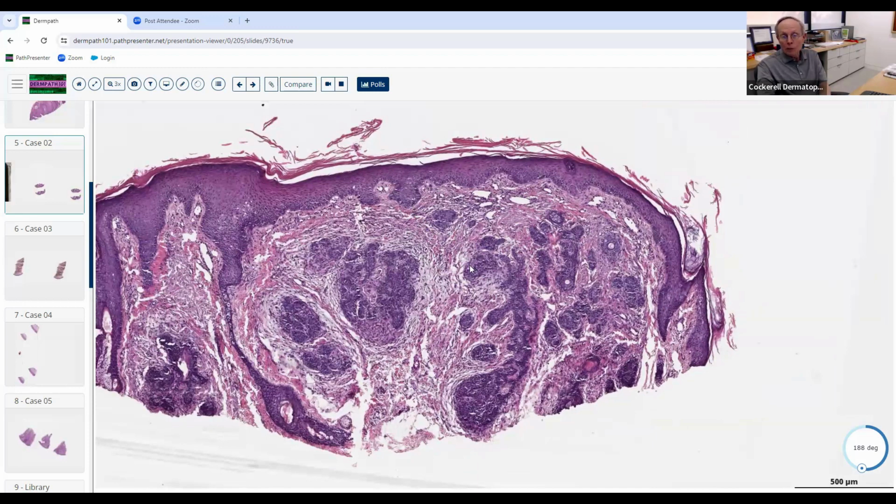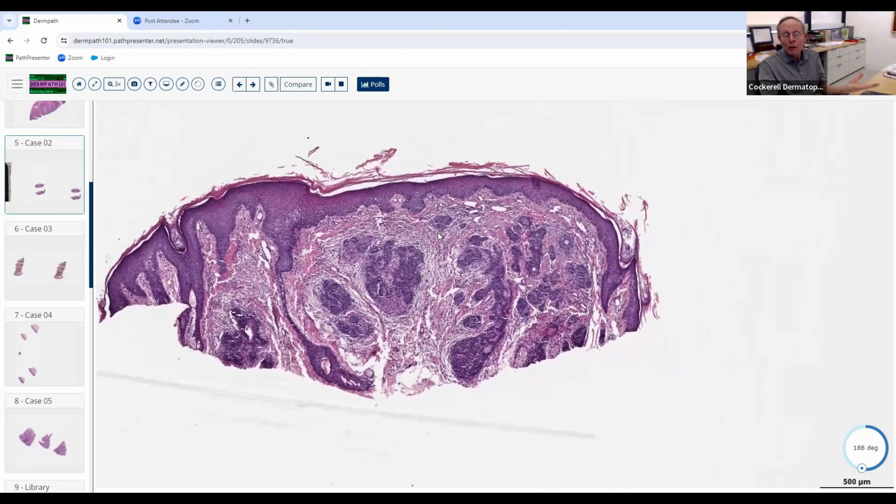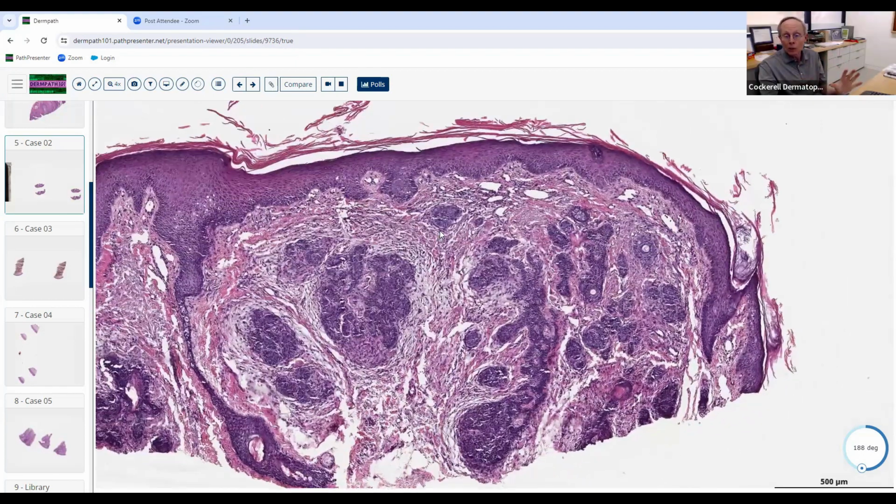And then surrounding, it's usually vertically oriented. And surrounding that, you'll see this perifollicular fibrosis, almost kind of an onion skin perifollicular fibrosis. So I would encourage you to go back to one or two of those, because they could ask that, because that does look quite a bit different than this lesion. The one kind of thing they probably would put in there would be basal cell. They wouldn't put something like just a benign follicular hamartoma, because that can look a lot like this.